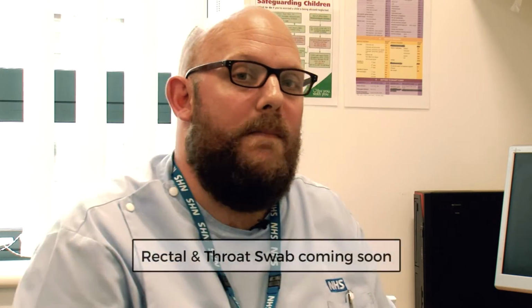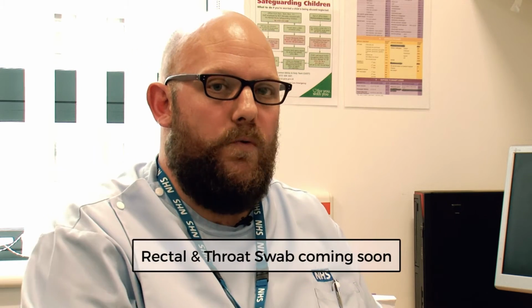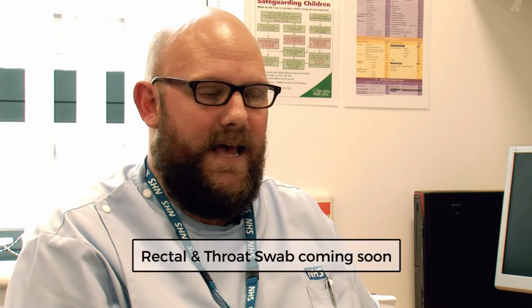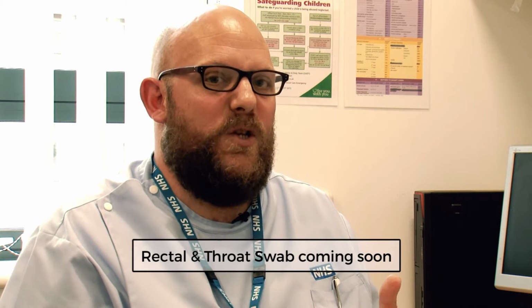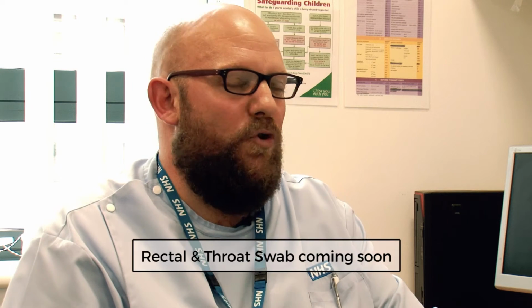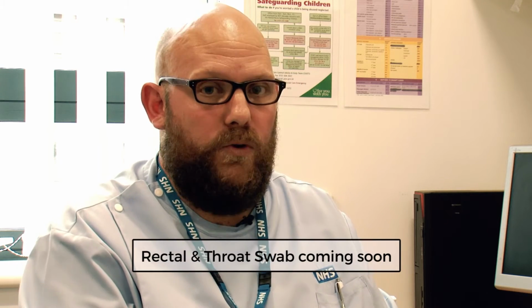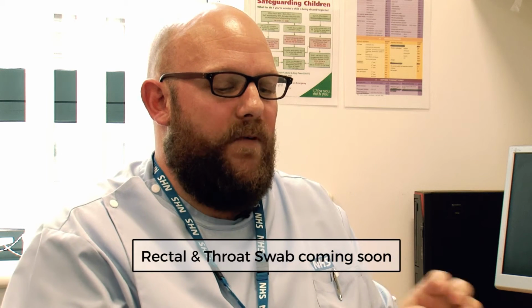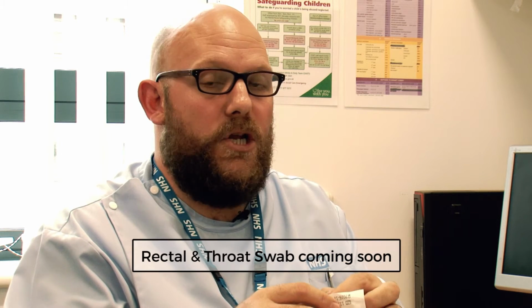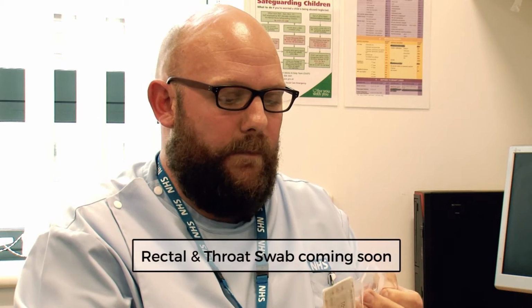Now, gay men we test differently. You'll still do the urine test, but you'll also do swabs, a throat and a rectal swab. The rectal swab if you feel you need it. Not every gay man wants the rectal swab, but they all do the throat. So it's the same swab for both. I'm only going to show you one, but tell you what to do with each one.